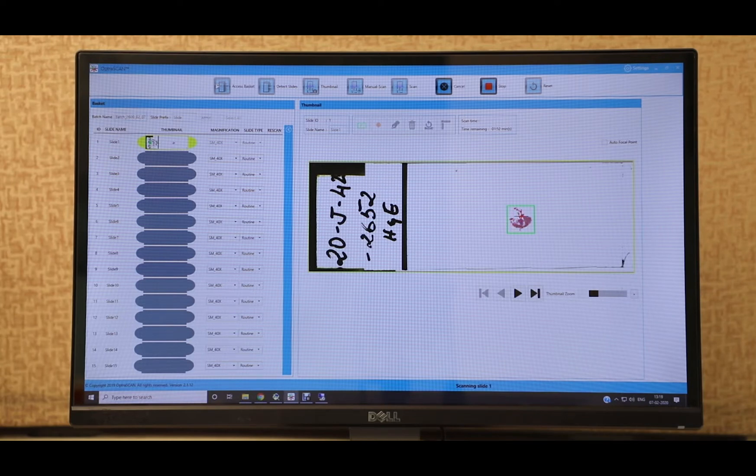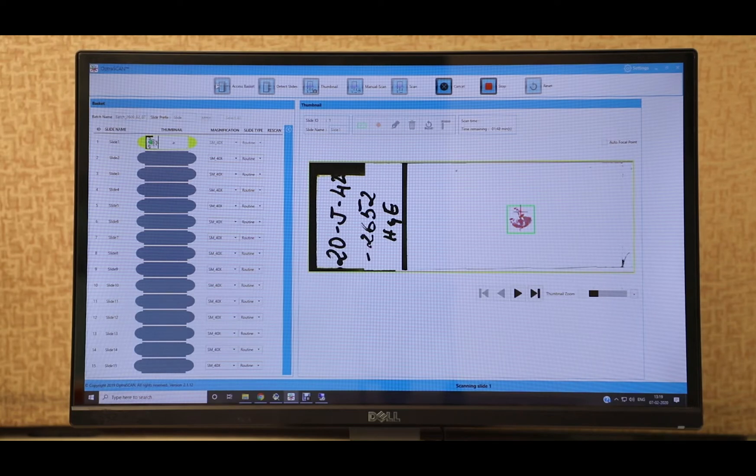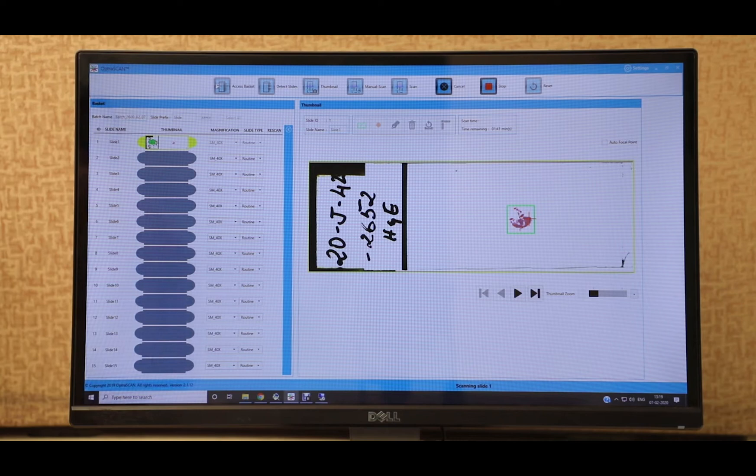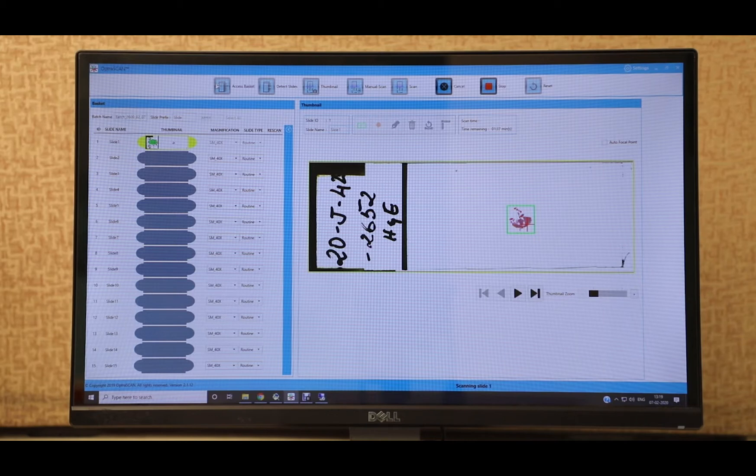This patented technology saves time during the scanning process by eliminating the blank areas from the scanned image. The red dot seen within the green box is what maps the best focal plane of the tissue sample, ensuring that all areas of the tissue sample are perfectly in focus.